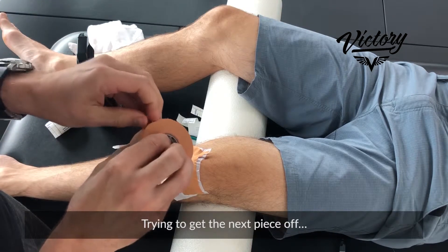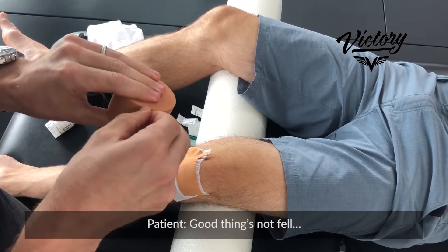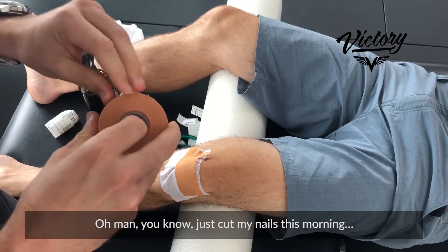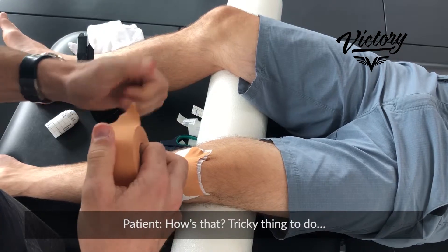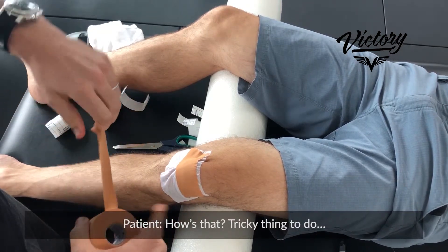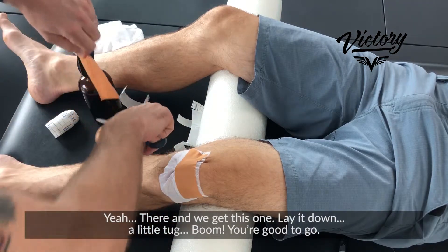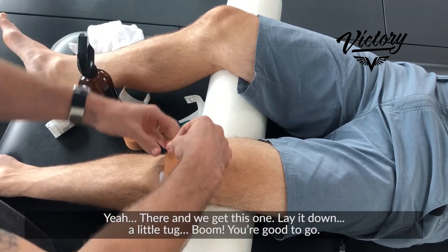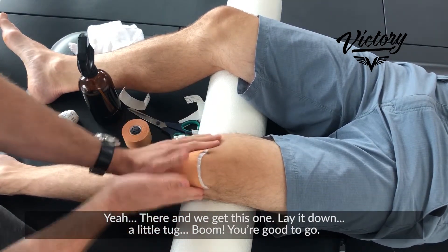Trying to get the next piece off — always a tricky thing to do. Alright, now we get this one, lay it down, little tug — boom, you're good to go.